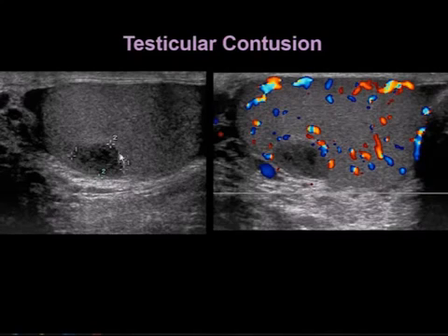Here we have the well-defined lesion that's hypoechoic and heterogeneous. And because it can be confused, this may sometimes come to resection. Also, remember I said at the beginning that 10% of testicular tumors, cancers, present with a history of trauma. So if this patient comes in and has this ultrasound where there's this focal hypoechoic lesion, we do need to raise concern that this could be a tumor.